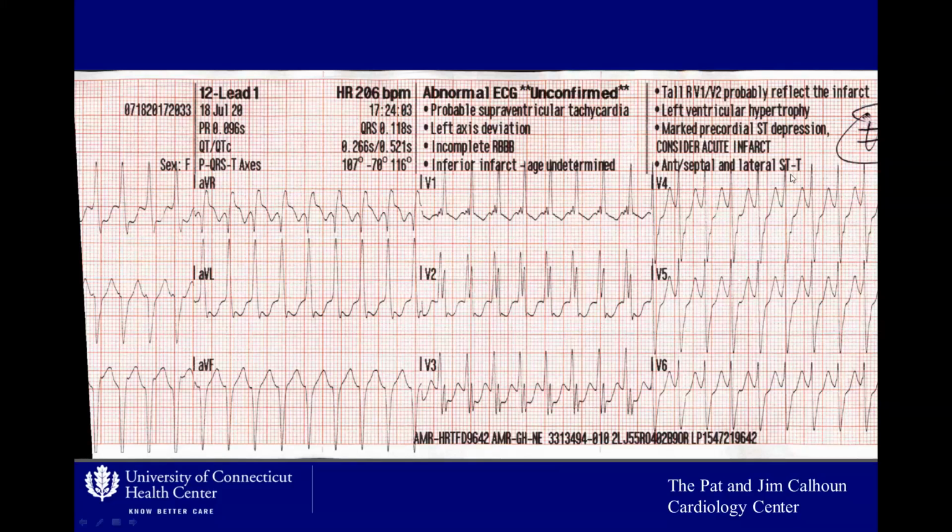No, in V6 we see it's wide enough. You guys see that, right? Look. It's really wide here. And if you look here, that is really narrow. You agree? This is barely 120 milliseconds, while here it's much wider. Here, if you look here, it's barely 120 milliseconds, while in V6 it looks like 160. So therefore you get fooled. Okay.